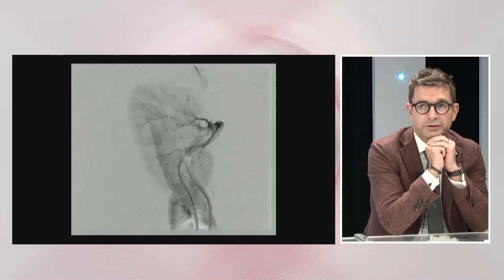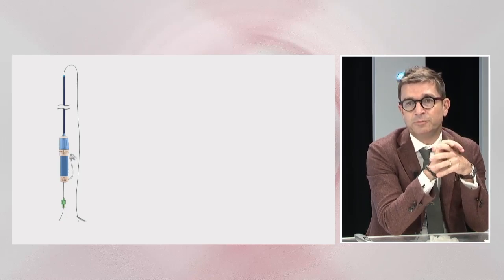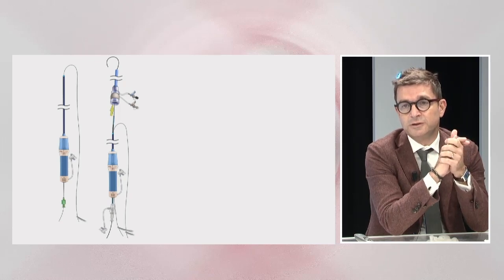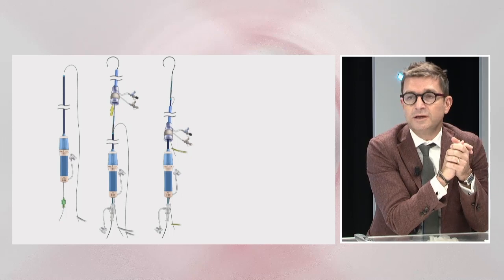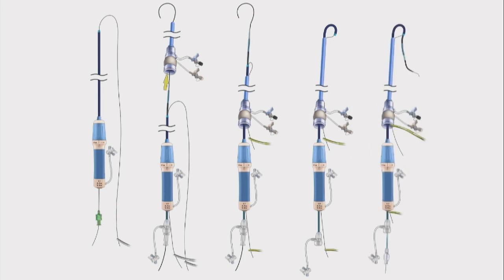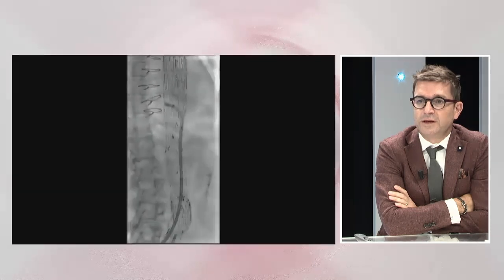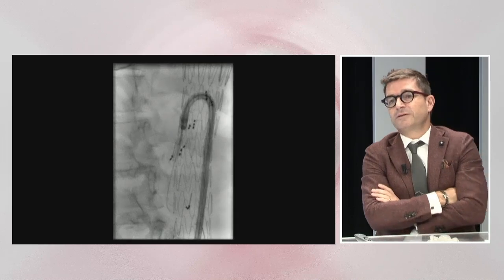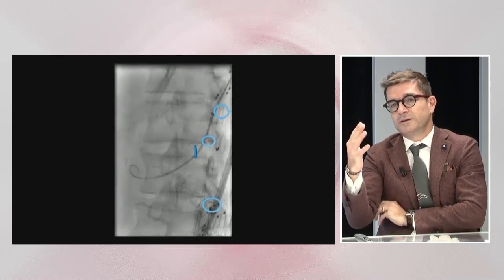Another feature we often use is to put dots at the bifurcation of vessels during planning so you can understand the length to the bifurcation — very handy on the celiac axis and renal trees, although not shown in this video. We are now doing ballooning with a 10mm balloon with no compression of any stents, followed by angiography. We also use digital fluoroscopy loops — the DSA run here is because I was worried about dissection.